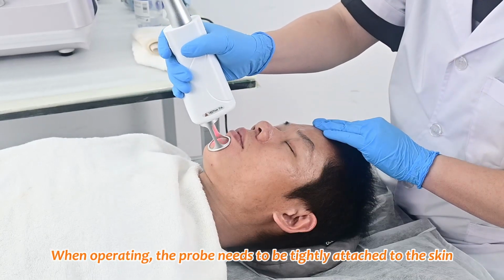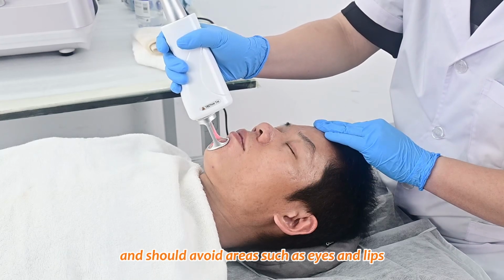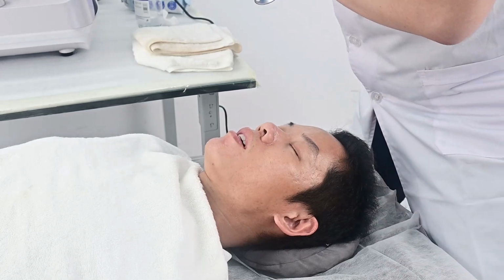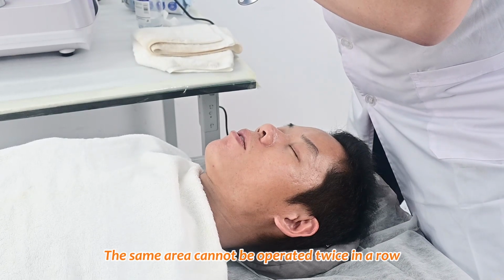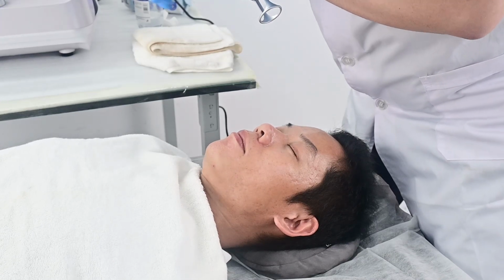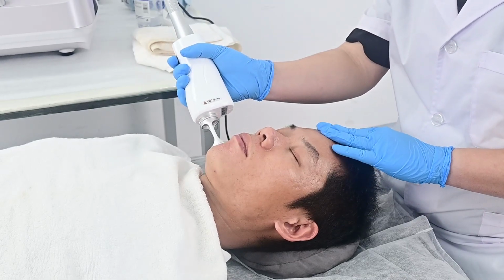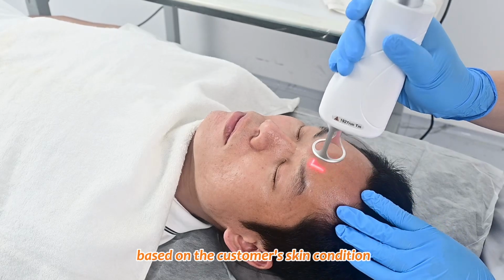When operating, the probe needs to be tightly attached to the skin, and you should avoid areas such as the eyes and lips. The same area cannot be operated twice in a row, to avoid excessive skin damage. We need to adjust parameters in a timely manner based on the customer's skin condition.